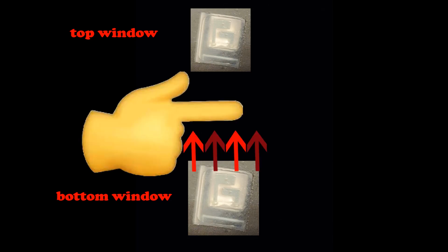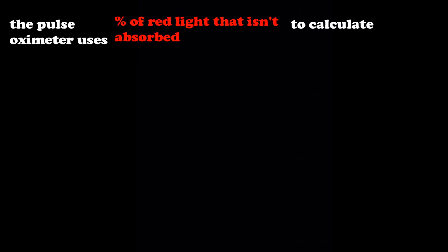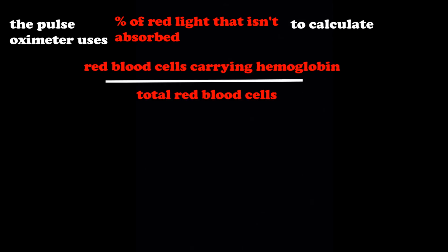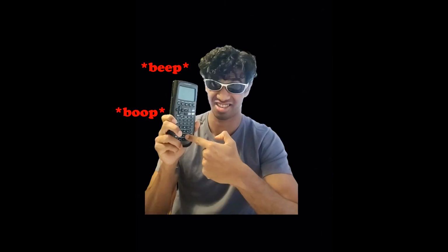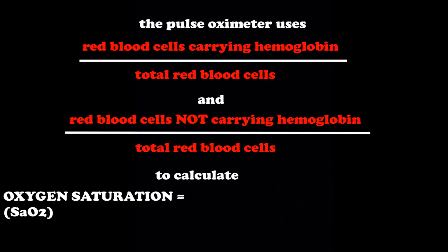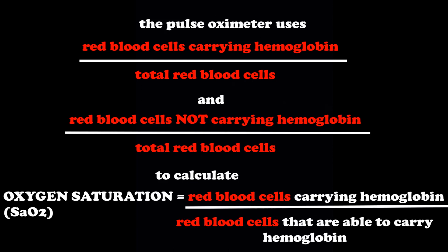So that second window is going to try to capture any light that made it through the gauntlet that you call your finger. It's going to try to capture any light that wasn't absorbed by any red blood cells, including both the red and the infrared light. And it'll record the amount of red light and infrared light that makes it to that window. Once this data is collected, the device will do something absolutely magical, and it'll be able to calculate the fraction of blood cells carrying hemoglobin, as well as the red blood cells not carrying hemoglobin, based off of the difference in light received by the second window clip. And when you crunch all these numbers together, the pulse oximeter can calculate your oxygen saturation, aka the percentage of red blood cells carrying hemoglobin over the total amount of red blood cells that are able to carry hemoglobin.